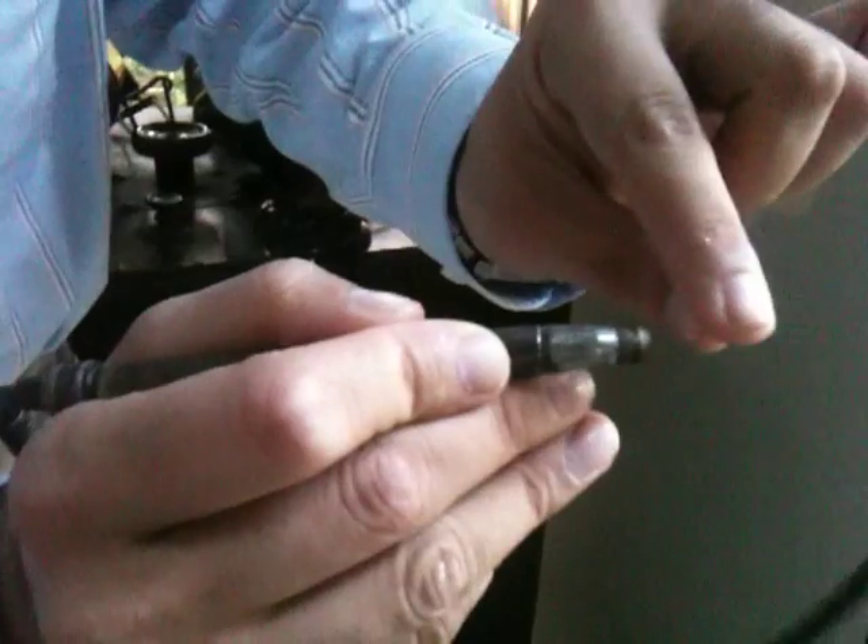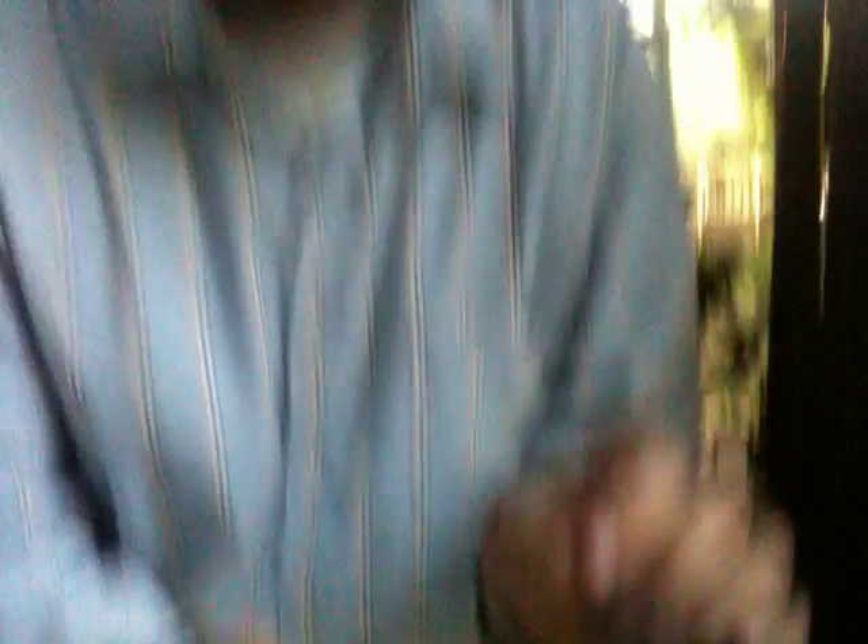There used to be a string around here, and the handpiece itself is right here. This is supposed to have a drill at the end, and what happens is the string attached to this wheel — you would pump this back and forth and it would rotate around and you would drill a hole in the tooth.